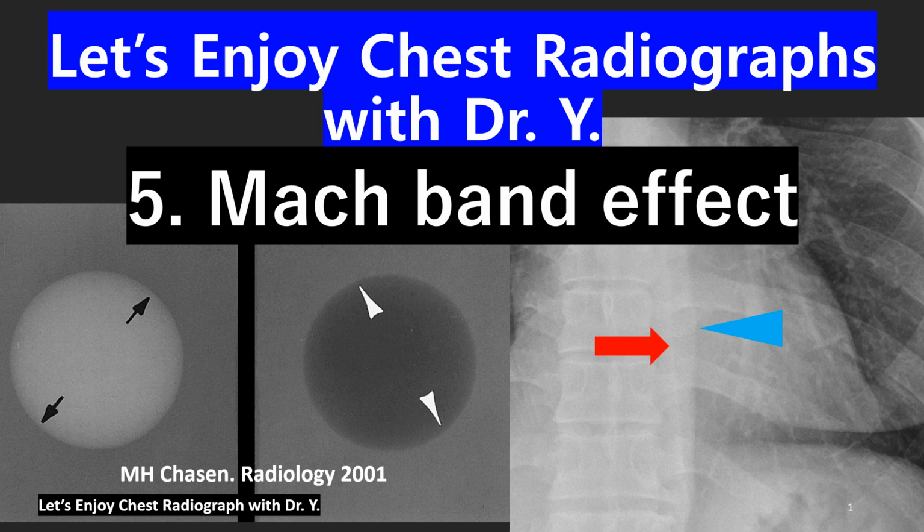Let's enjoy chest radiographs with Dr. Y. Session number 5, Mach Band Effect.